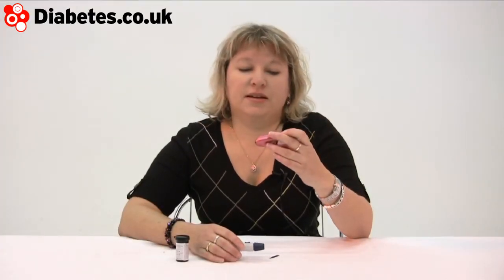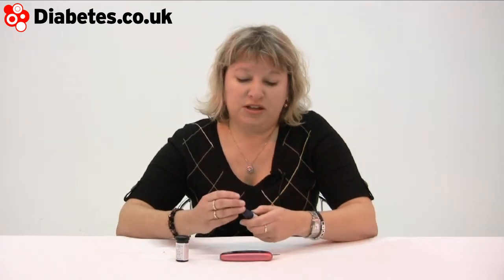This is the OneTouch Ultra Easy from LifeScan, and it is pretty much what it says on the tin. One of the things that healthcare professionals have to address is the fact that a lot of people, given the excuse, won't blood test as often as maybe they should. What blood test machines have to overcome is that resistance, so by making the machines as simple as possible and as attractive as possible, it should encourage people to blood test.